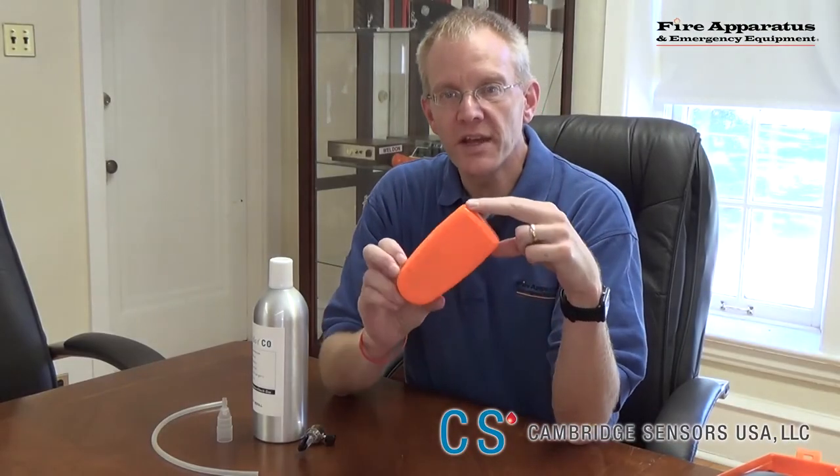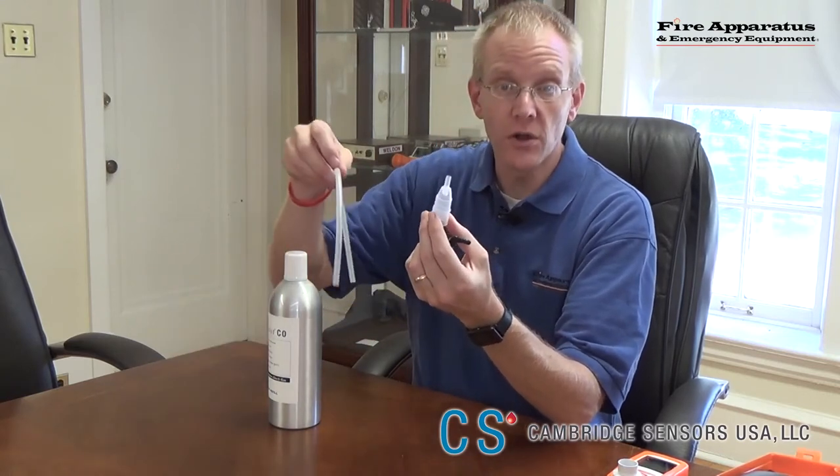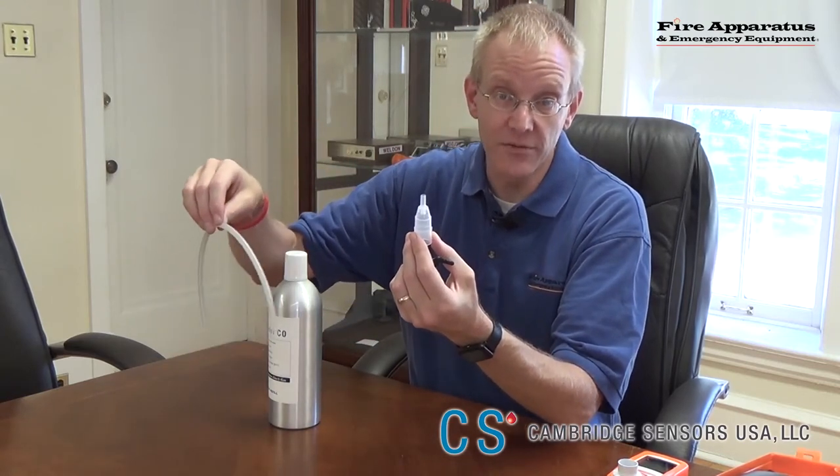The Micro.CO breath analyzer is also available with a protective cover, and it will need to be calibrated every six months. To do so, there is a kit available from Cambridge Sensors USA. That kit contains a canister of 100 parts per million CO, the valve, the funnel nozzle, and a hose — all needed to complete the calibration test every six months.